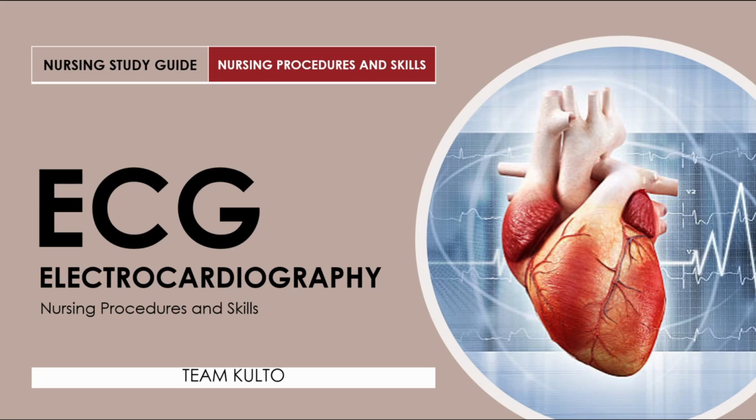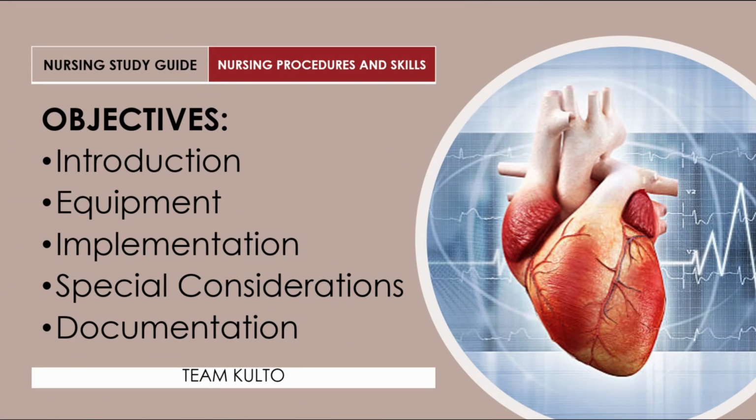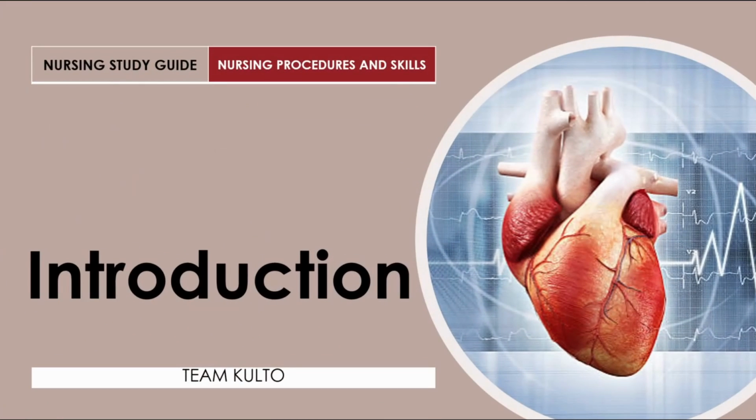Okay, simulan na natin to. Wag na tayo magpatumpik-tumpik pa. Okay, what are the objectives of our today's discussion? I'm going to give you an introduction, the equipment that you're gonna use in conducting your ECG, implementation, special considerations, and of course, documentation. What is the proper documentation when it comes to ECG procedures? Okay, so handa ka na ba? Let's begin. So, introductions. Isa munang overview.